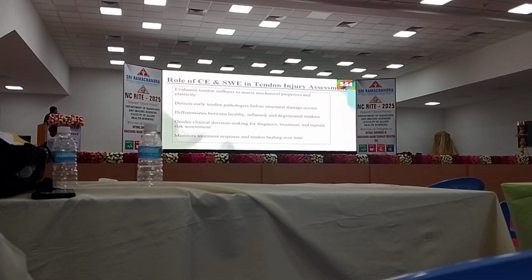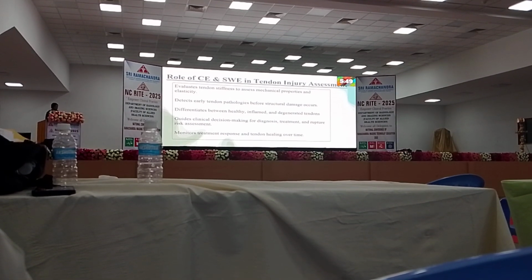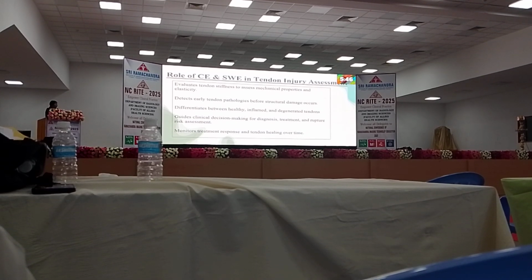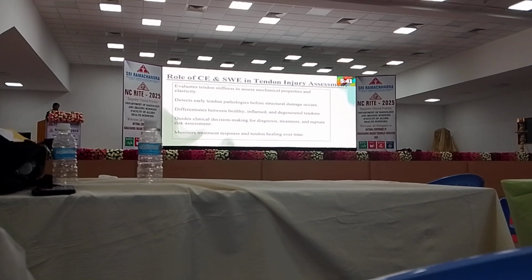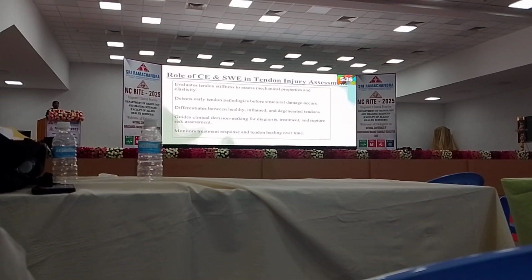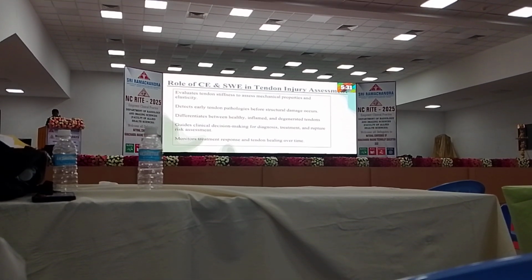Now talking about the integral topic of our presentation: the role of CE and SWE in tendon injury assessment. As I said before, it evaluates tendon stiffness to assess its mechanical properties and elasticity. It helps detect early tendon pathologies before any structural damage occurs. Also, it helps differentiate between healthy, inflamed, and degenerated tendons. It also helps guide clinical decision making for diagnosis, treatment, and risk stratification assessment. It also helps monitor treatment response and tendon healing over time.